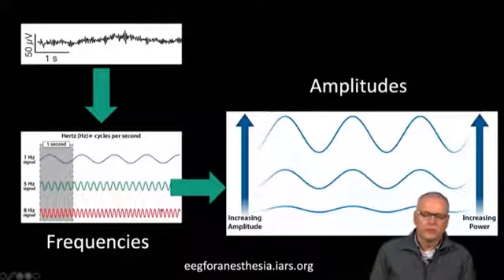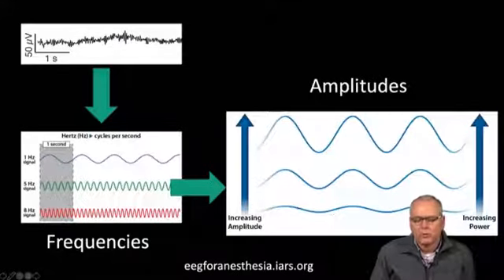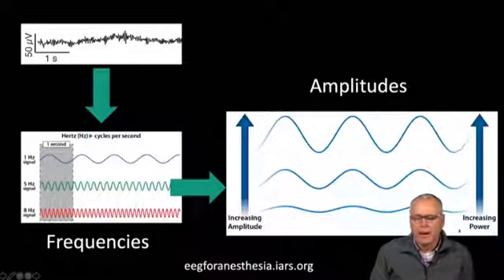Then there are also amplitudes. For example, a given waveform may have low, moderate, or high amplitudes. And amplitudes are usually characterized with the word power.